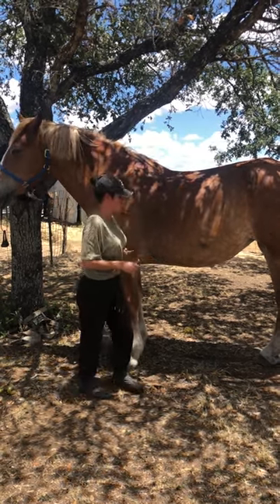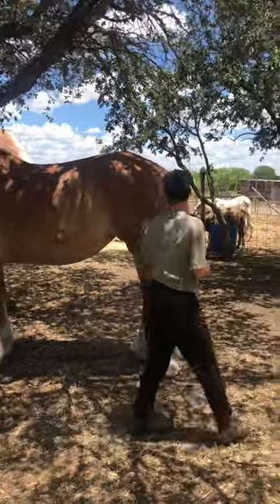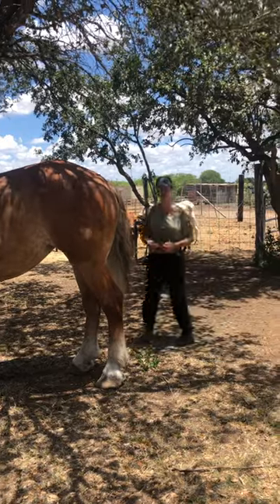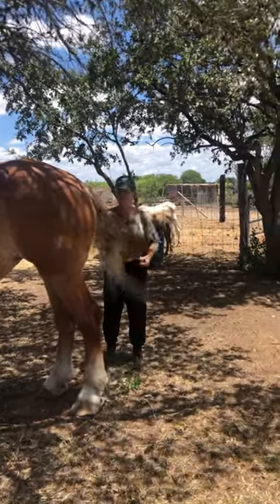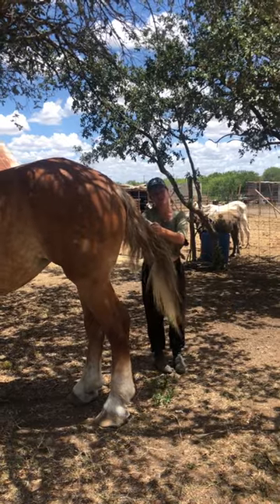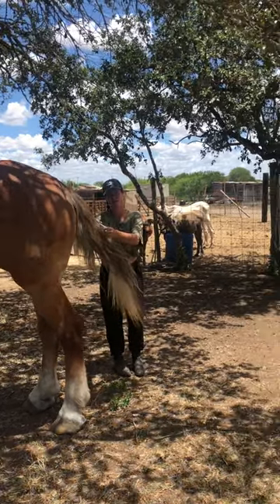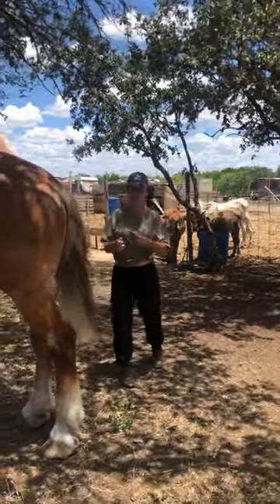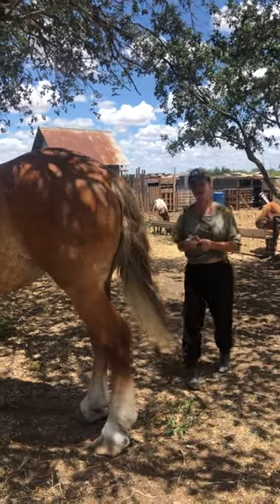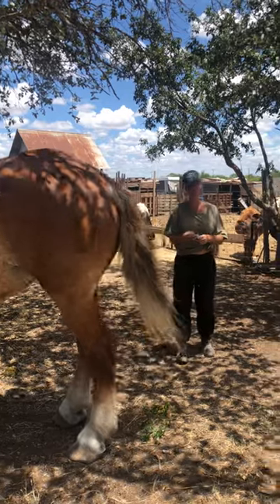When you're doing a thermometer, you're going to stand from the side from the horse's tail to make sure you don't get kicked. You're going to lift the horse's tail and put the thermometer in the horse's anus, or the rectum, and then you stay there until it beeps and then you take it out and you have the horse's temperature.